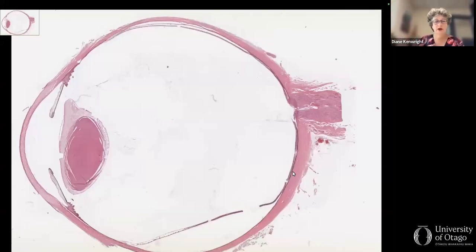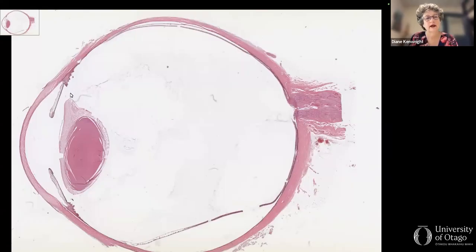In this video, I'm going to go through the second glaucoma case, which is phacolytic glaucoma. At low power, we have the cornea, which looks pretty normal. Note the angle is open and that the iris has got a corrugated anterior border. Same over here. What we have here is the lens, and the nucleus is intact, but the cortex is all pale and fluffy looking. This is an artifactual divot here.